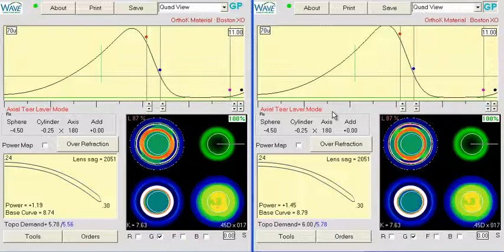So if we have 3/4 remaining, then I would probably put a target of an additional half diopter here. So our target would be around a 1.95. Oftentimes what I do is I just build the exact over refraction or residual refraction right into the power of the lens. So even if we went up to a plus 2.15, I think that would work out okay.